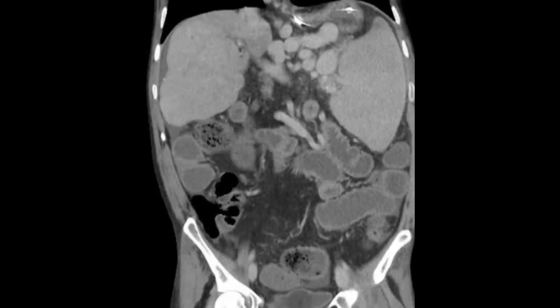MRI and DSA can also be used, but as far as accuracy of ultrasound and CT is concerned, they are second to none. So that was all about portal hypertension. You can easily pick splenomegaly, portal vein dilatation, portosystemic shunt, and enlarged mesenteric vein on ultrasonography. On CT scan it will also show extra-hepatic presentation: small bowel wall thickening, gastric wall thickening, portosystemic shunt, and ascites. With some new information we'll see each other next time — take great care of yourself, bye.